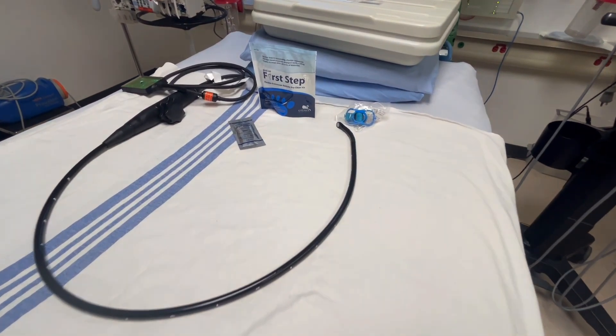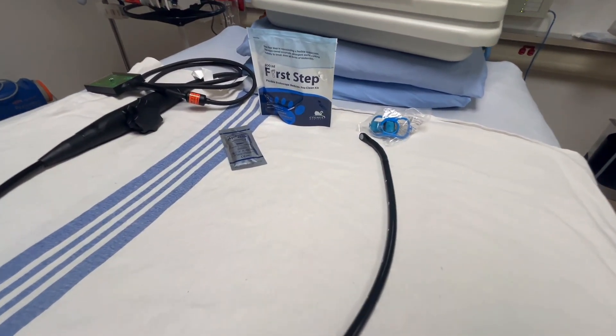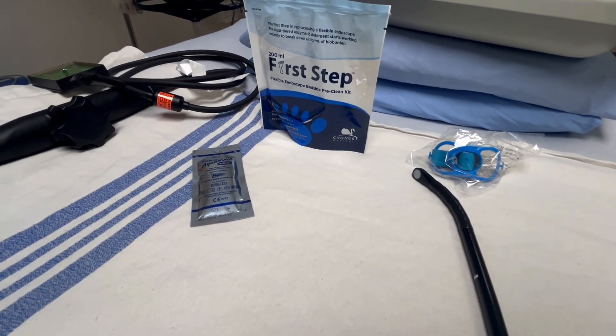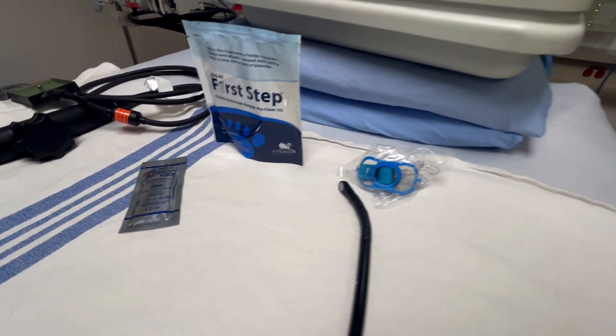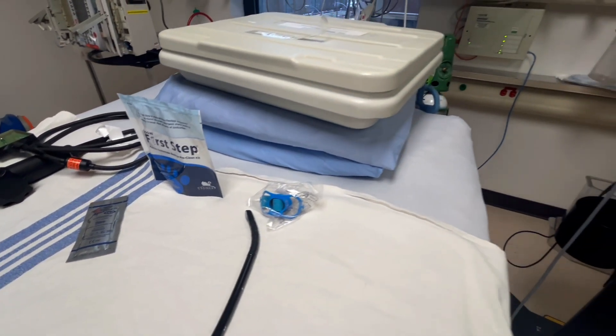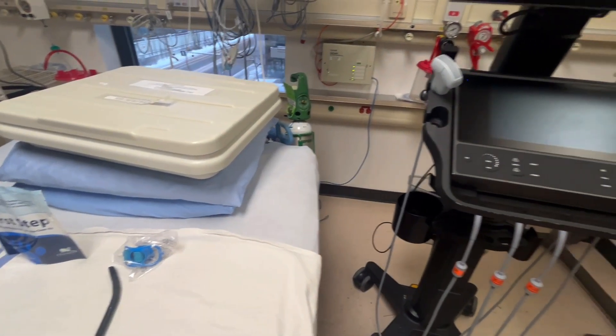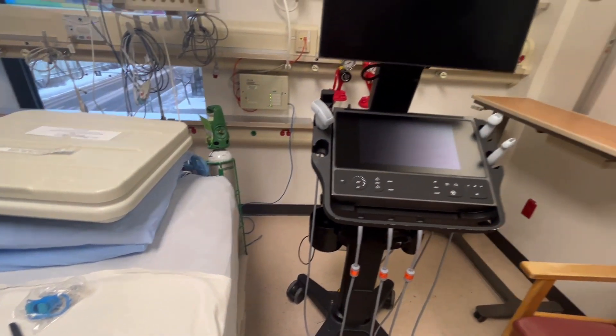Here you will find displayed the necessary equipment to perform transesophageal echo. You will need a probe that is compatible with your ultrasound machine, gel, first step cleaning solution or equivalent, a bite block, a case for carrying the probe, as well as the ultrasound machine that is compatible with your echo probe.